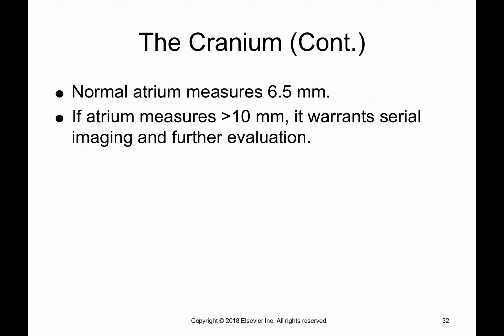So the normal atrium of the lateral ventricle measures 6.5. If an atrium measures greater than 10, it warrants serial imaging and further evaluation.